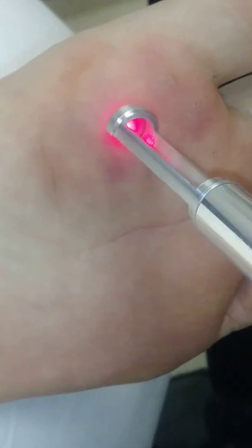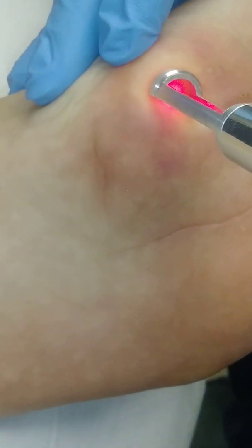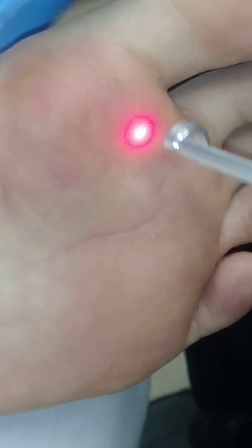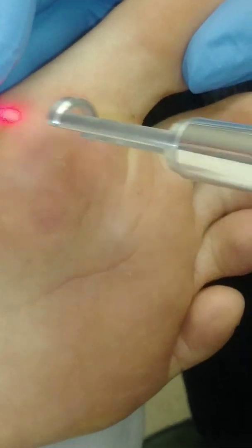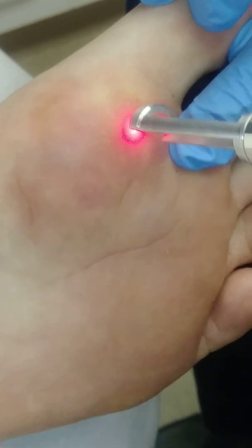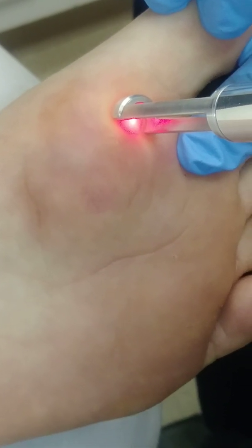I think we're about 90% — just want to make sure we didn't miss any. One spot there where there's a little bit. Some more bleed when you trim them. These really are not ones that bleed very much, which makes it better in some ways but a little more difficult sometimes to see. So we're looking for these little islands of abnormal skin.